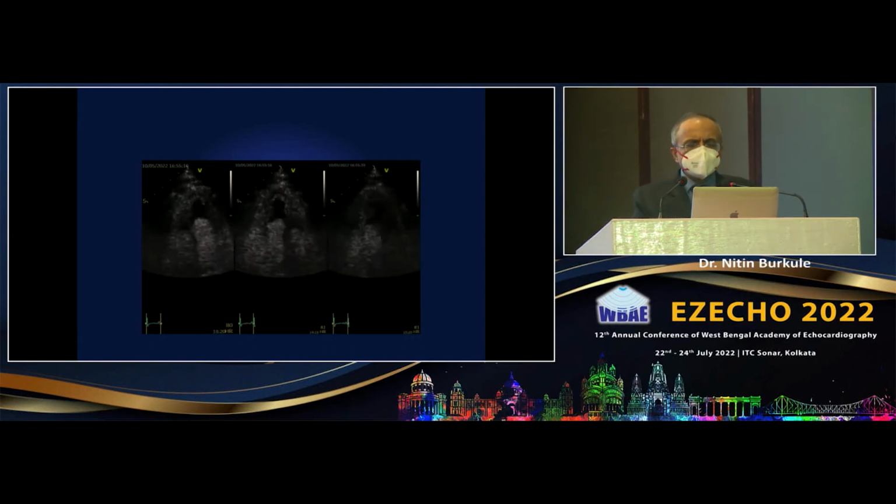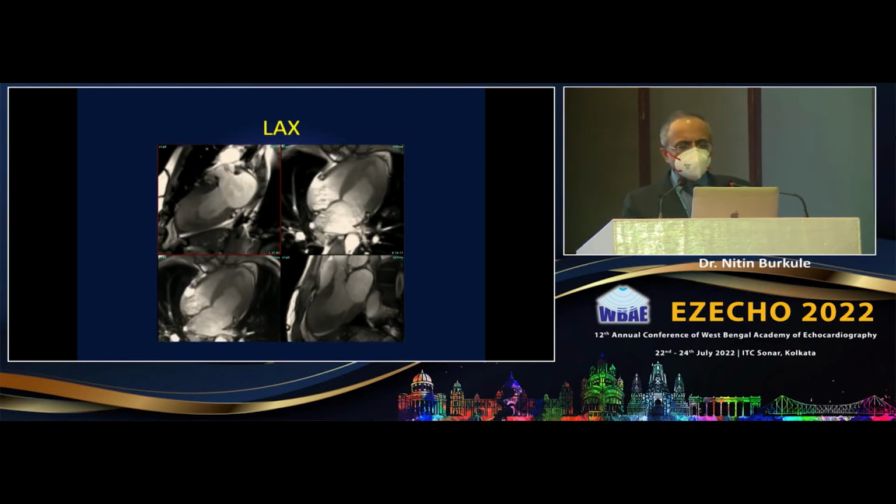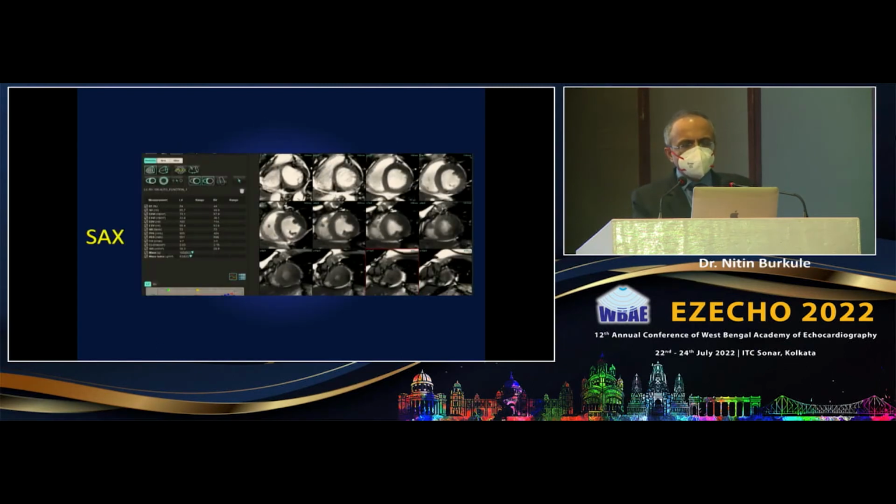So look at the MRI images, and the first thing you can see is that the filling defect is actually quite hyperintense as compared to the myocardium, and it is distinct from the myocardium. If I look at the short axis, it shows me the same thing.